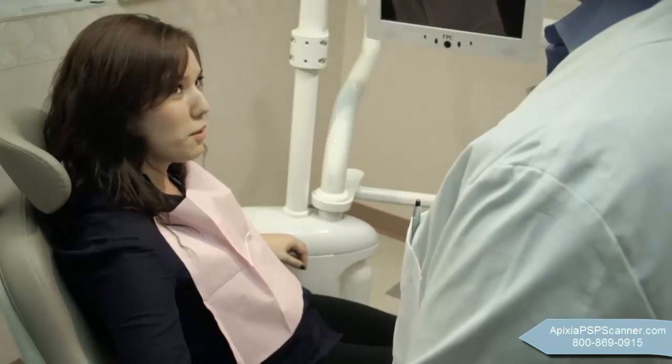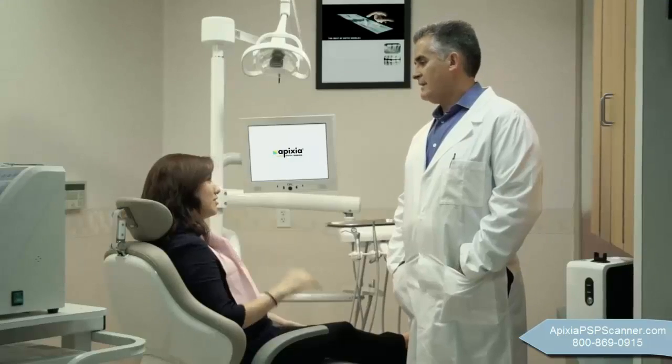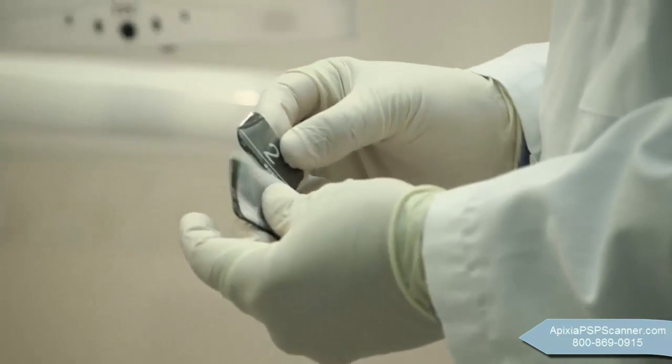Phosphor plates have all the traditional benefits of X-ray film with the speed of high-tech digital radiography. With the wireless Digirex PSP Scanner, there's no need for hazardous and costly film processing chemicals. Patient comfort is assured with thin, flexible plates in multiple sizes.